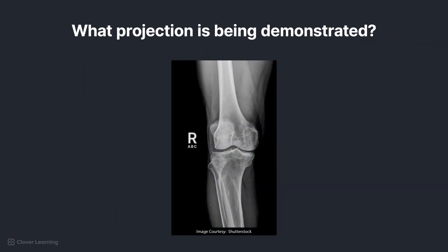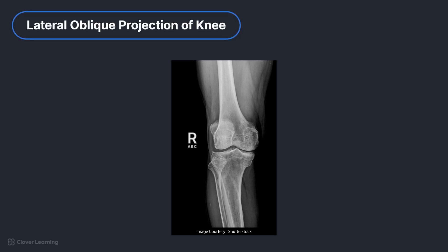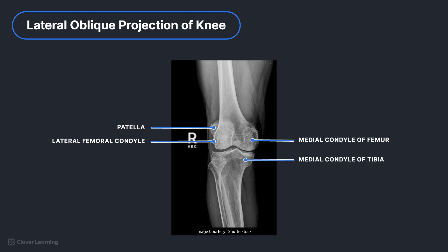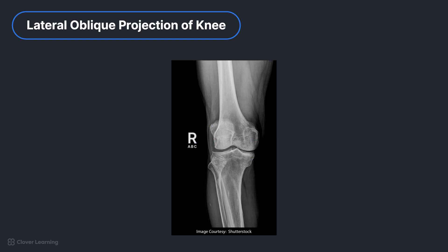Can you tell what projection of the knee is being demonstrated here? Did you say lateral oblique projection of the knee? Let's find out how we can tell it has external rotation. Like the other projections, the distal femur and proximal tibia and fibula are demonstrated, but this time the patella is superimposing the lateral femoral condyle, and the medial condyle of the femur and tibia are shown in profile. Also, in this projection, the proximal fibula should be superimposed by the proximal tibia.